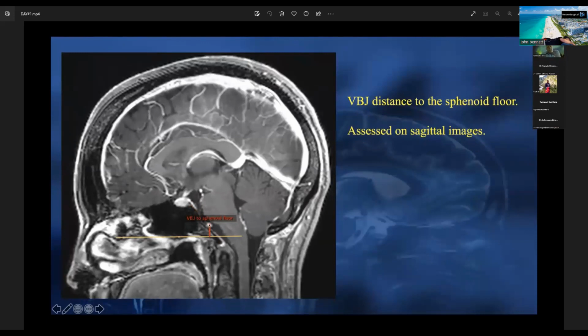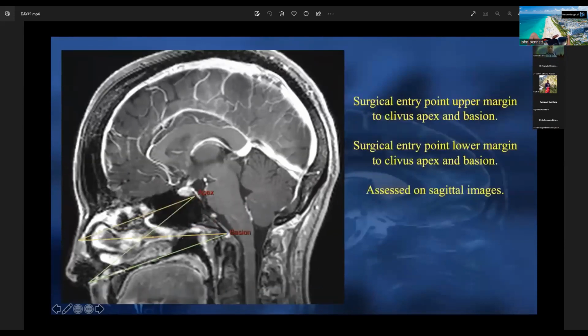And the reason we wanted to know that is because when you see the scan, you know where you can reach, but also intraoperatively for intradural lesions. I'm not talking about extradural, but how to find these anatomical parts. Then we did this measurement, which I will show you, which is the entrance from the nasion to the hard palate in the front.